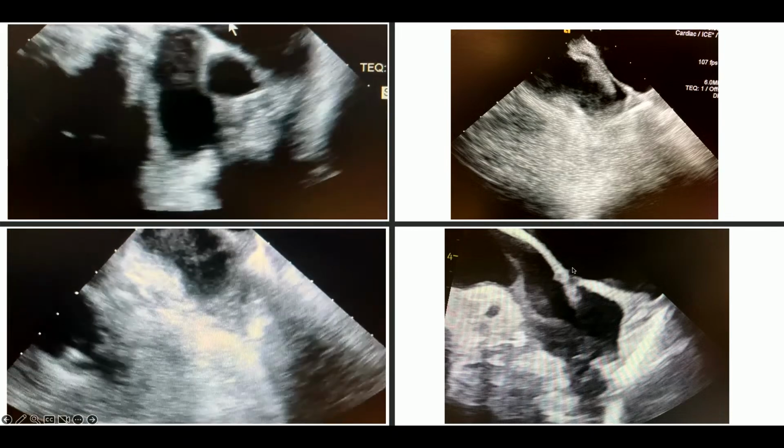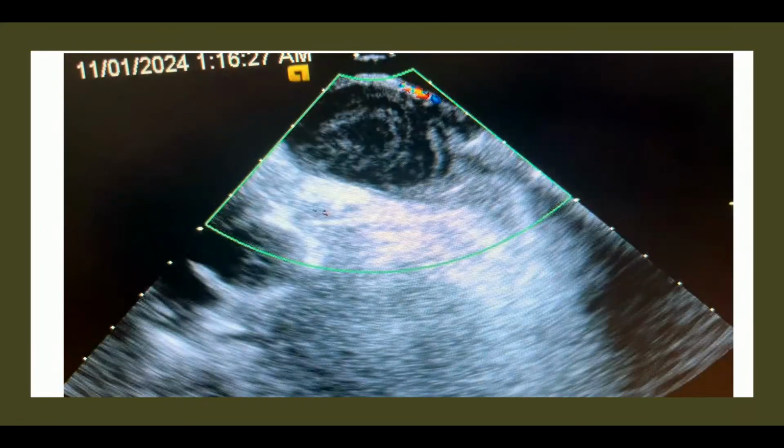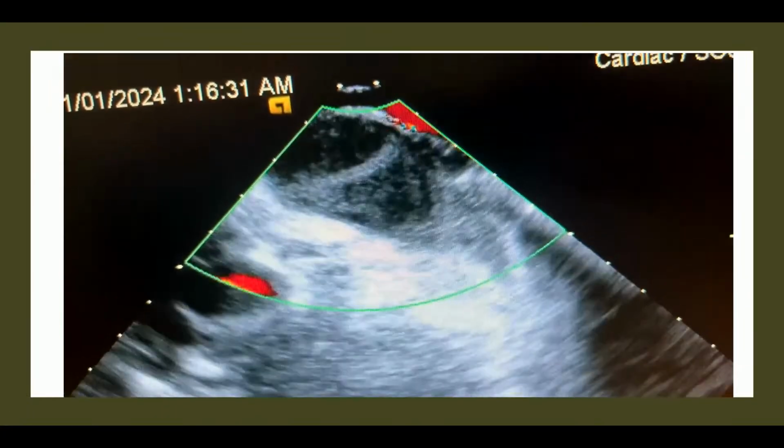So yes, you can obviously see. Obviously, you want to detect it before you get to there. But sometimes we don't. Sometimes we're there and we check this way, okay? So this is a color. You can see we were doing color flow there, and, sorry I didn't put the velocities there, but there's nothing that goes in there.